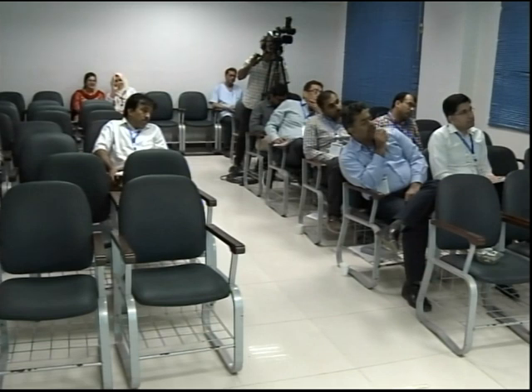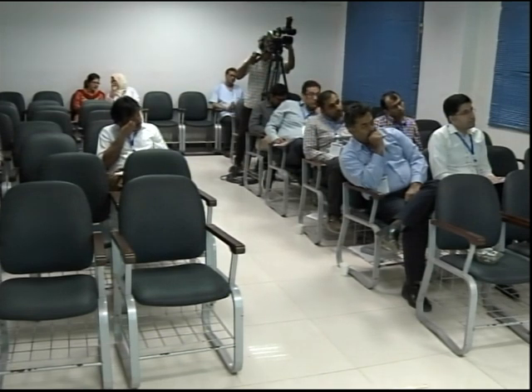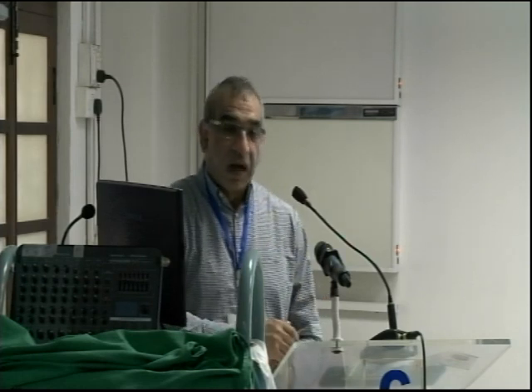तो उसमें ये होता है कि आप एयर बिल्कुल निकाल दें and come right out. तो वाटर में ये होता है कि बड़े मजे से कोलोन आपका बैठ जाता है. और उसमें we tend to use, हमारे पास है एंडोगेटर जो ये पंप होता है, so it's not all that costly. उससे भी syringes से करें तो बहुत syringes आपको डालने पड़ते हैं. एंडोगेटर से वाटर पंप डालें तो it's very effective. But that's total colonoscopy under water.